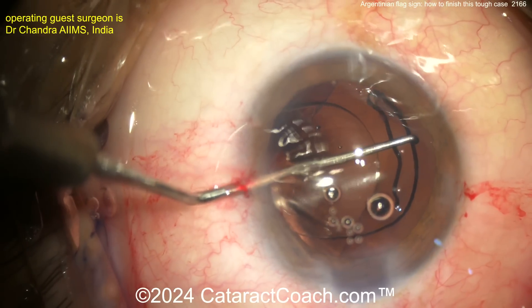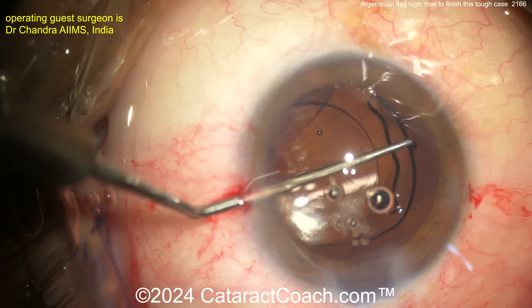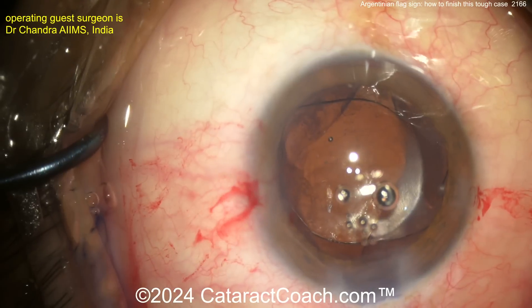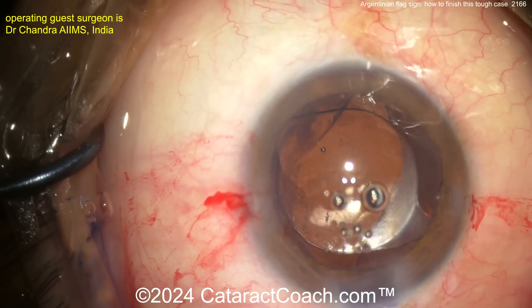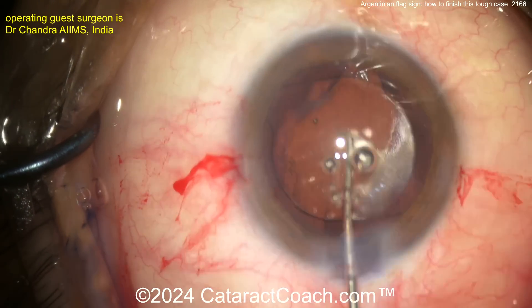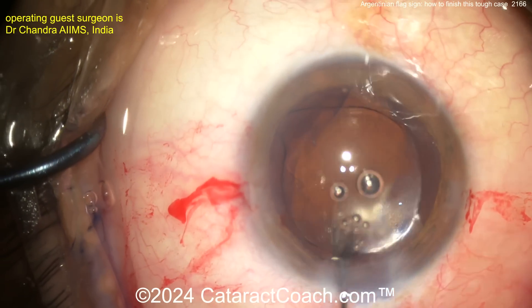A bare, minimal amount of manipulation. Don't manipulate this too much — let's just get out of this. Just get out of the eye, get this case done. The lens looks pretty well centered up, definitely in the capsular bag. You can see the two leaflets of the anterior lens capsule overlapping the optic. Haptics are securely placed 90 degrees away from the area where the capsule zipped out.